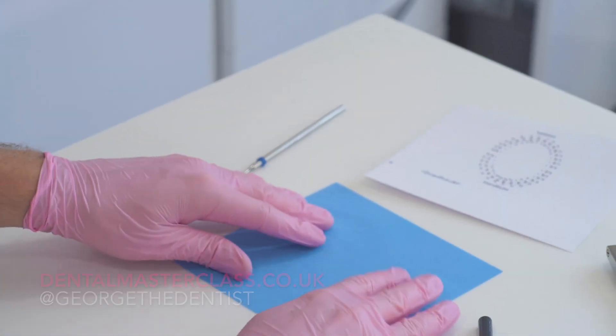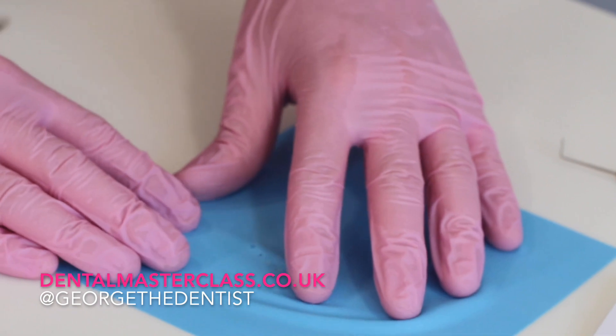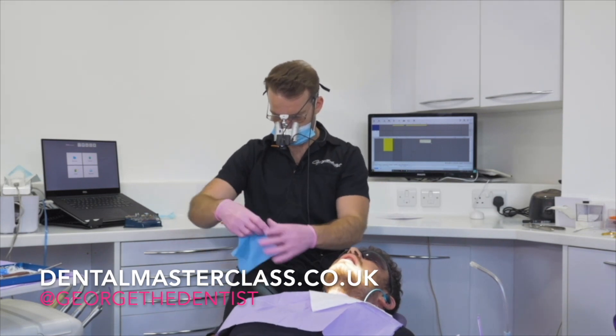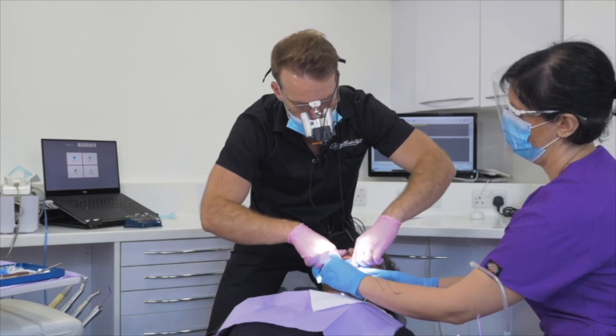So now the rubber dam is going to be ready to go. What I'll then do in the mouth is use a clamp for the seven. I commonly like the W8A clamp and use that for most things. I'll get my clamp over that tooth, get the posterior hole over the clamp, and then floss the other holes through. When I place my rubber dam, I will usually place it so it's at least one tooth behind the tooth I'm prepping, and I'll usually try to isolate a whole quadrant.